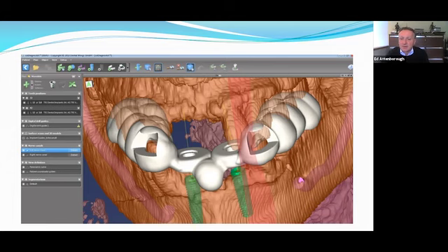In this case, for the placement of 2 anterior lower implants. And the way the process works is that merging the intraoral scan data with the DICOM data improves the accuracy of the DICOM data. You can actually see here, CT data typically works on 1/2 mil slices. Obviously, the resolution of CT data is directly proportional to the amount of radiation dose that the patient's given. So typically, it's 1/2 mil slices or 0.25 mil slices, and that is fine in terms of looking at bone density and planning where the implants are going to go.